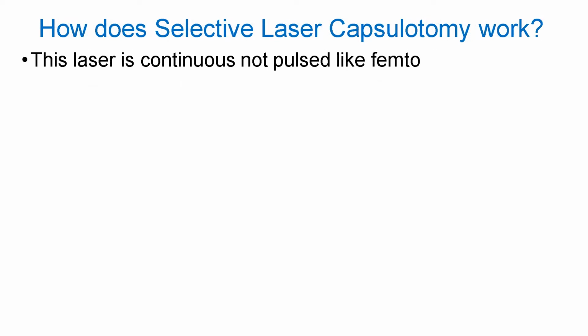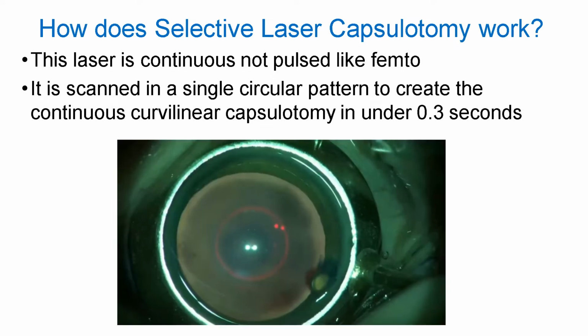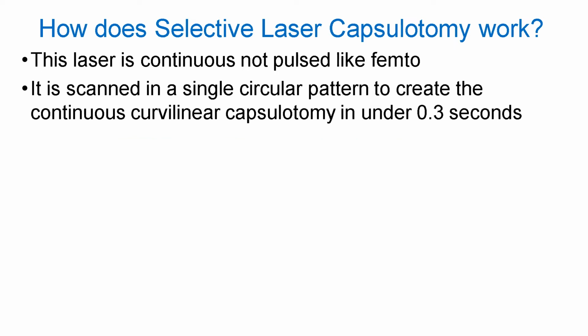This laser is continuous, not pulsed like femto. It is scanned in a single circular pattern to create the continuous curvilinear capsulotomy in under 0.3 of a second. And we can see that here. The laser beam is being centered and the capsulotomy is created very quickly.